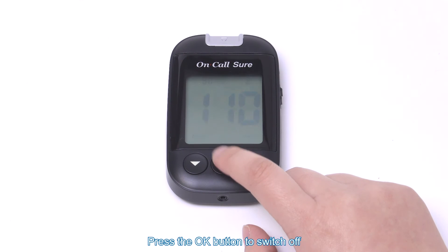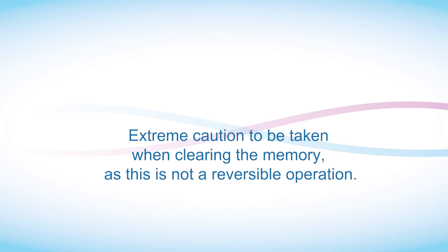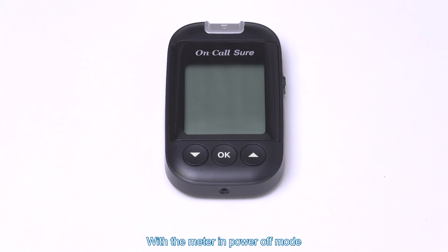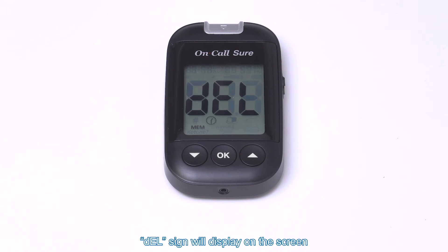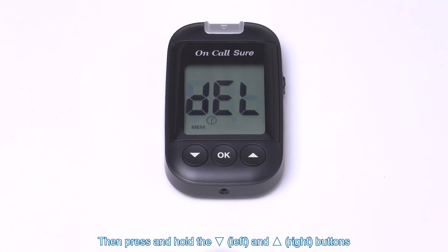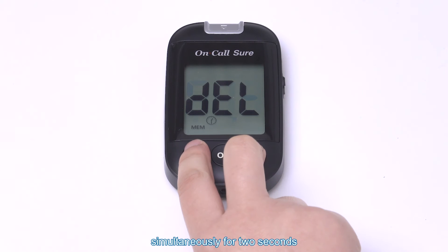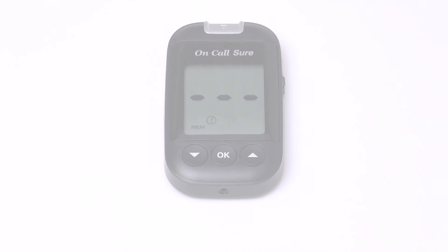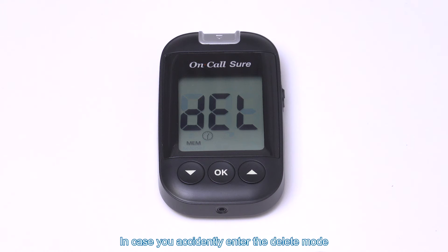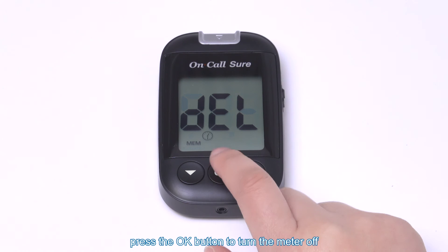Press the OK button to switch off. Clearing the memory: extreme caution is to be taken when clearing the memory, as this is not a reversible operation. With the meter in power off mode, press and hold the left button for 2 seconds. A DEL sign will display on the screen. Then press and hold the left and right buttons simultaneously for 2 seconds. The display will show MEM and dashes, which means the memory is cleared. In case you accidentally enter the delete mode but want to exit without deleting the recorded data, press the OK button to turn the meter off.